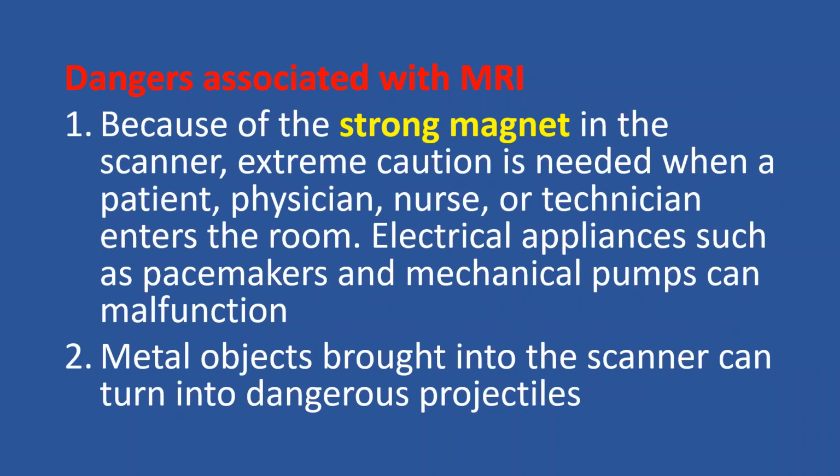What are the dangers? I want to tell you a brief story. I needed an MRI of my spine. I had back pain. I came into the MRI room. The technician told me, only you need to remove your shirt and undershirt. Fine. My iPhone was in my back pocket. As I was having the MRI, I felt that I had a big blow on my behind, and then suddenly my pants tore and my iPhone came out of my pocket and went up to the ceiling and hit the ceiling. If you have a large magnet, this can happen.